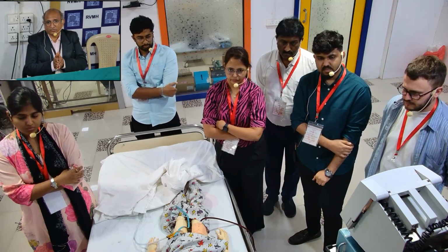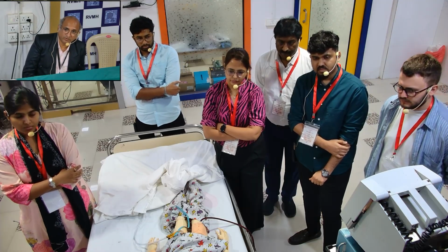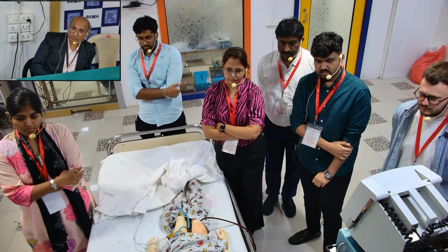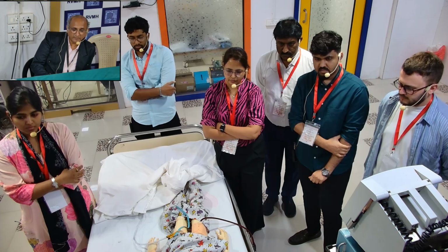Because the cannula will get obstructed because of the tamponade effect. So that's again going to be more of a gradual rather than a sudden response that is going to come. Okay, and probably in that also we are going to get to see a chattering. Okay, fine. So well done.